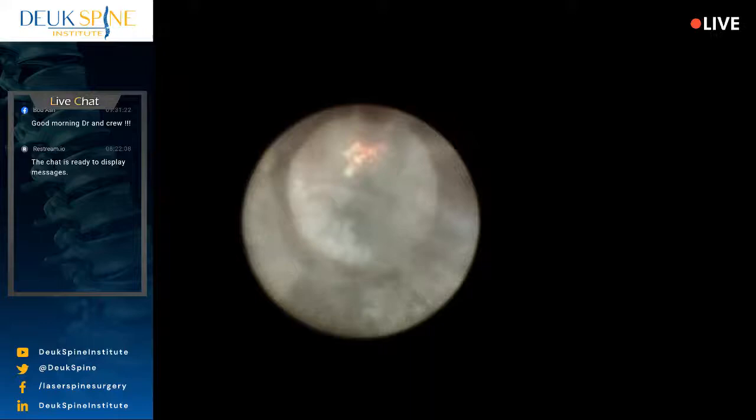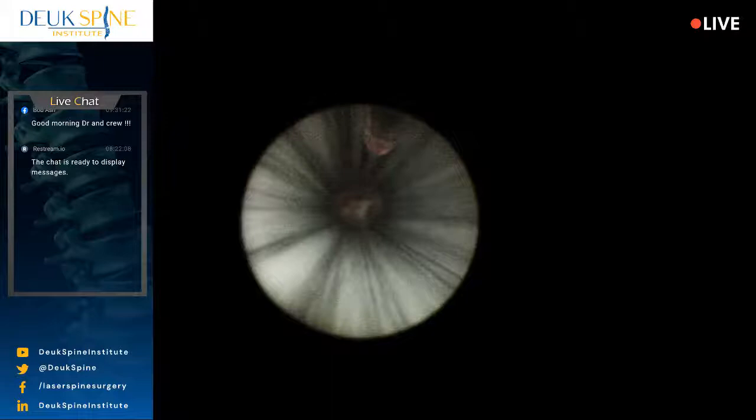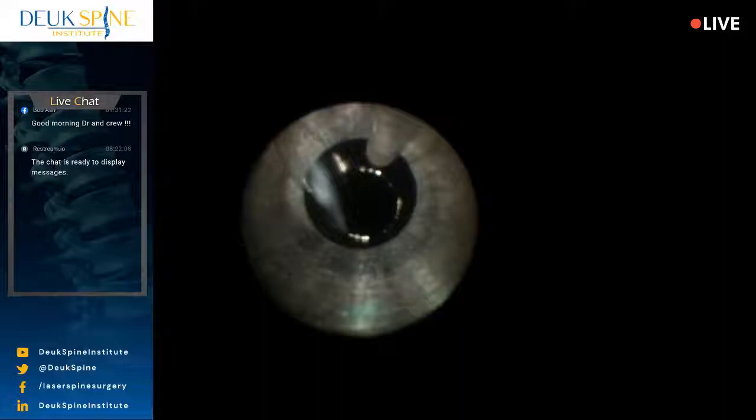I mean, there is cavitation, obviously. Cavitation is, there's a herniation right there. You see that piece of herniation that just came out? We're going to float it out. So what we're doing in this surgery is removing the herniated fragments of disc, the nucleus, and that stains blue. And look how collagenized it is. It's scarred up. And we're debriding the annular tear.